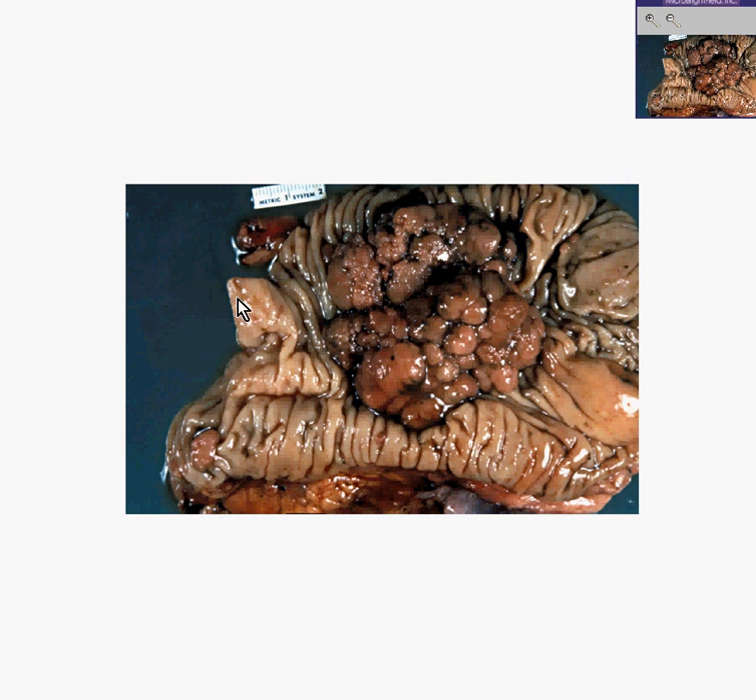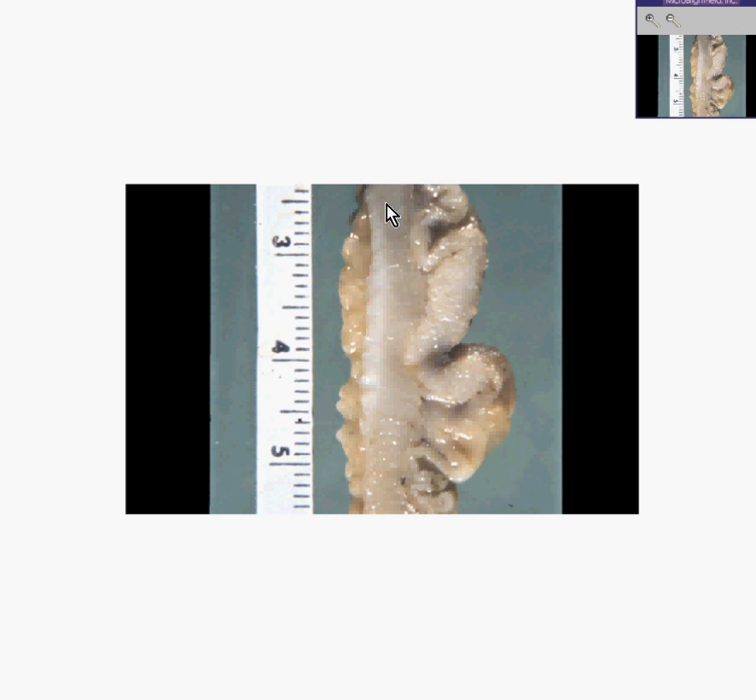If you take a cut through this tumor at its thickest part, or where it appears in closest association with the muscular wall, you might see something like this. There is a little part of this that has actually grown into the smooth muscle. For a colon tumor to grow into the smooth muscle is even worse prognosis than if it limits itself to the submucosa — this is a higher stage, a higher Duke stage.